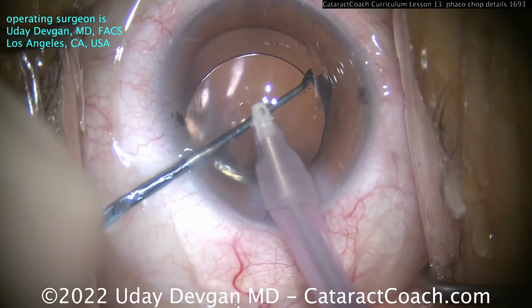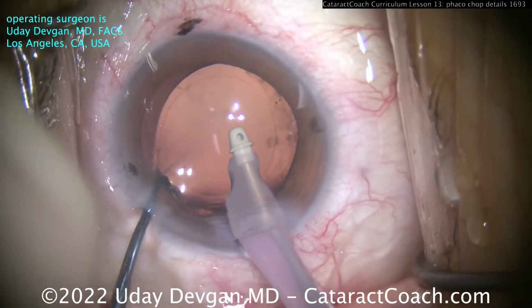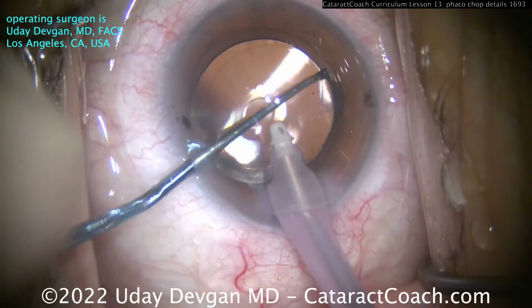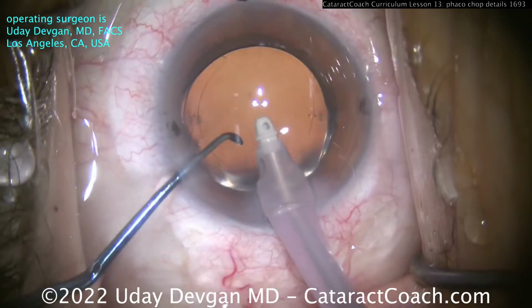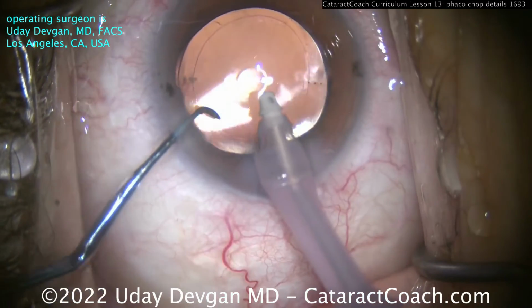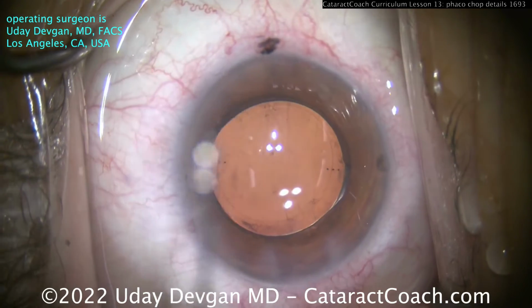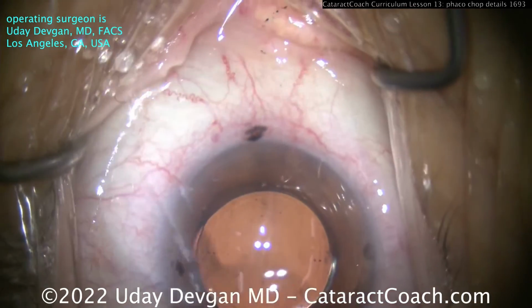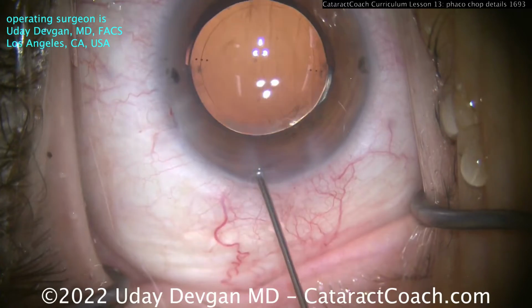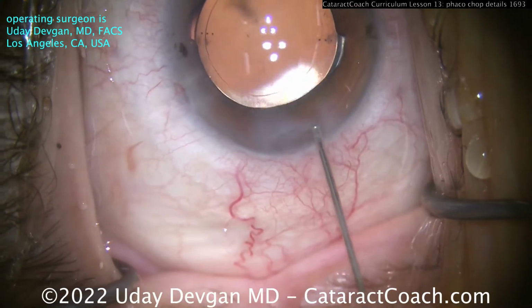And we'll rotate those lens haptics around so we can line up the 3 dots of the toric IOL with the 3 dots on each side at the cornea. And you can see that's a really good alignment there for both the marks. And then even the Purkinje images are beautifully centered in the middle of that special optic. This is an optic that has a beam shaping element in the center, and we want that lined up with the first and fourth Purkinje images.